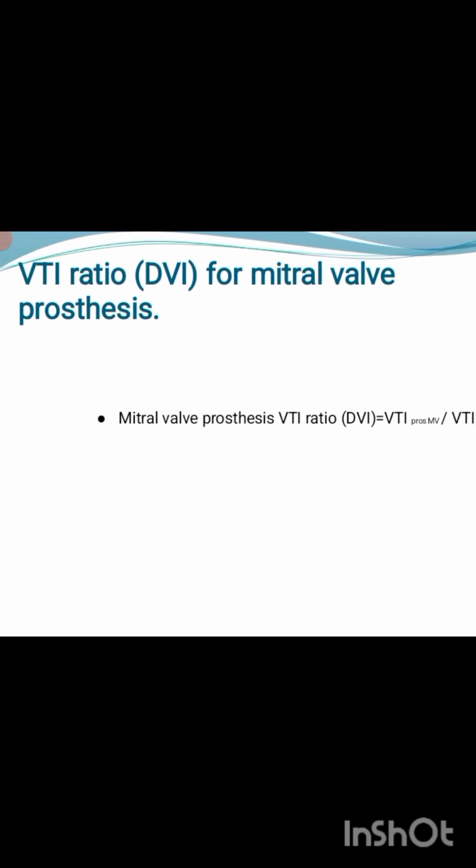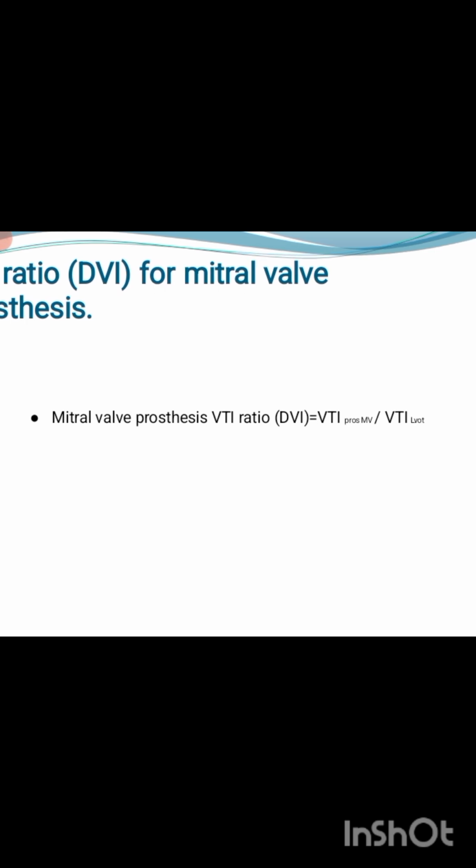This is the DVI formula for the prosthetic mitral valve: VTI of the prosthetic mitral valve divided by VTI of the LVOT.